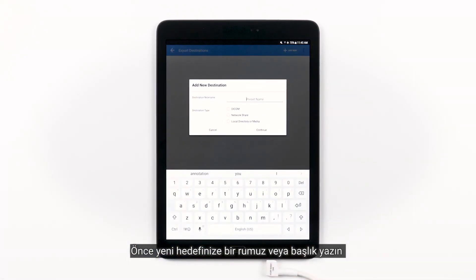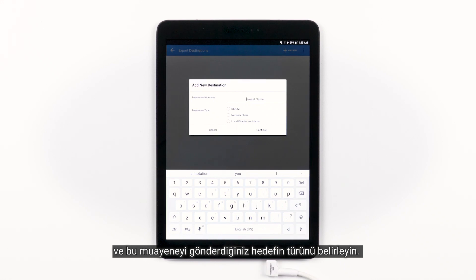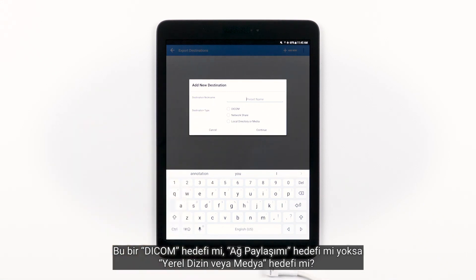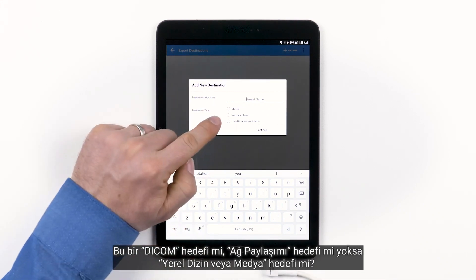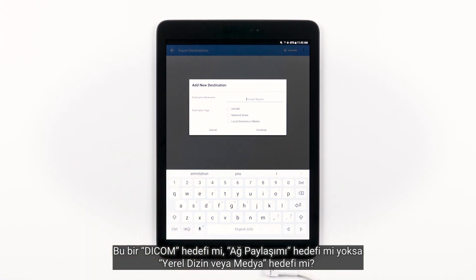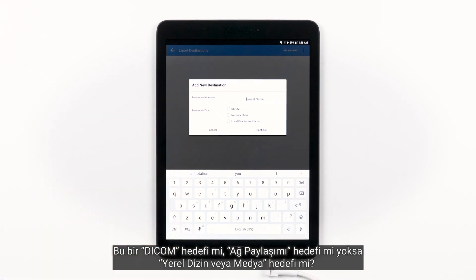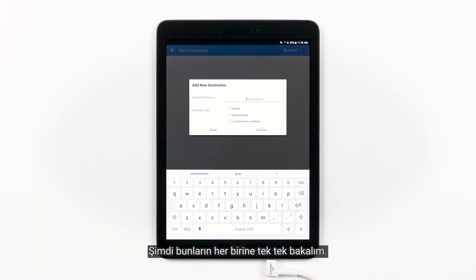First, go ahead and give your new destination a nickname or title, and determine what type of destination you're sending this exam to. Is this a DICOM destination, a network share destination, or a local directory or media destination? Let's take a look at each of these one by one.